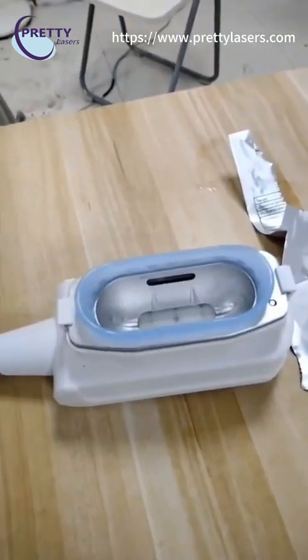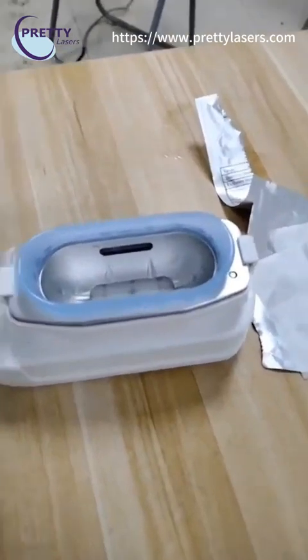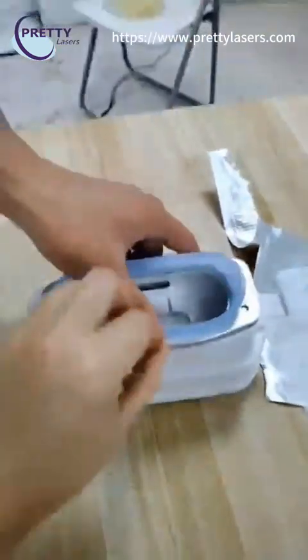When you want to remove this part, press on both sides and take it out directly.